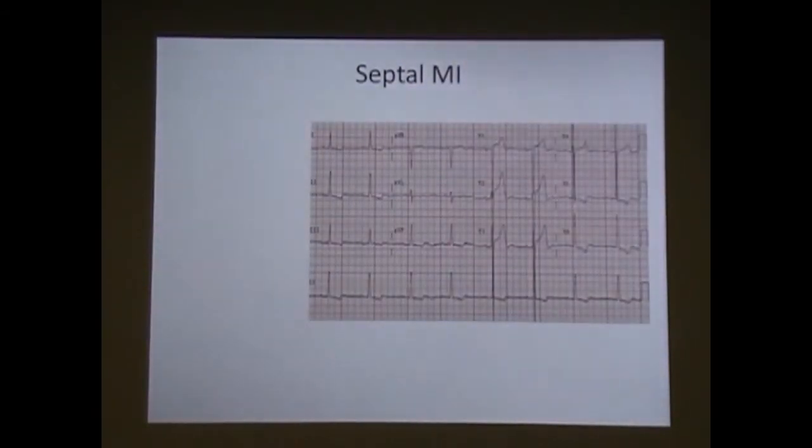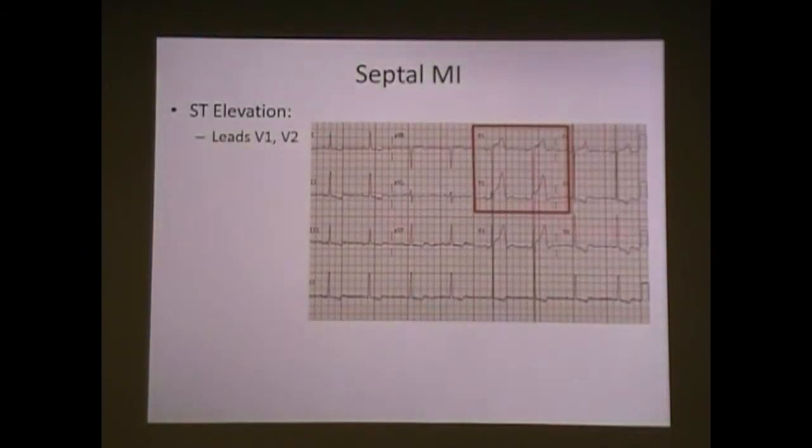Okay? Septal MIs. Elevation in leads V1, V2. If you look, this picture doesn't show just V1, V2. I've got lead V3, a little bit in V4. Okay?